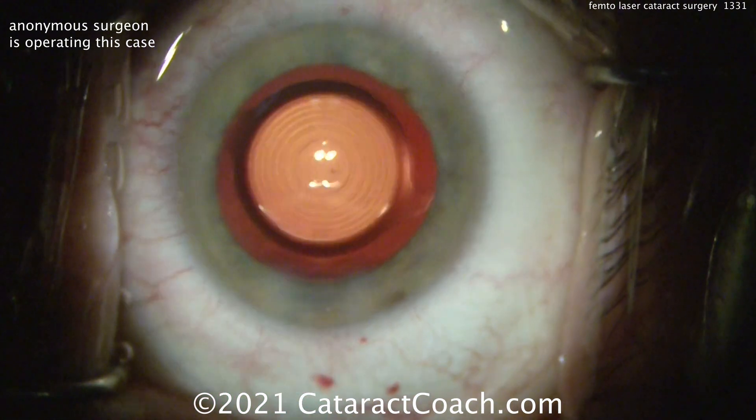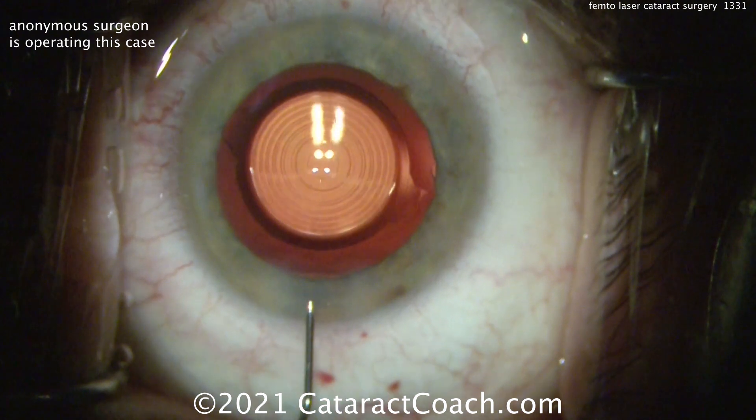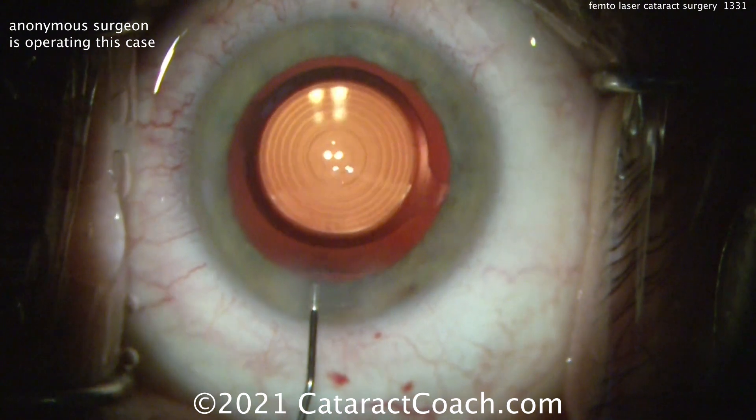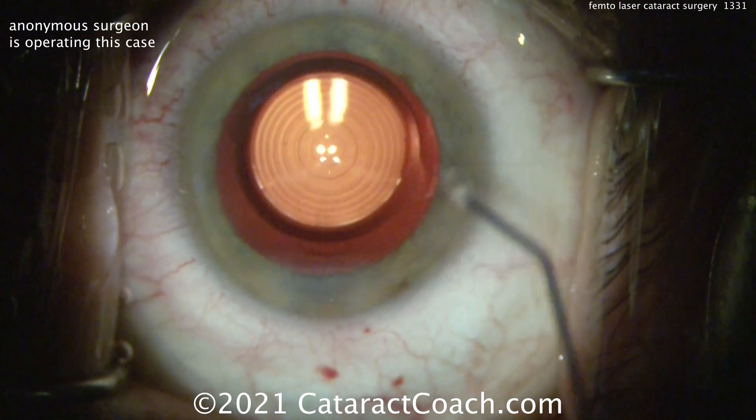So cleaning up pretty nicely. Looks like it's pretty well set — time to seal up the incisions, call it a day. So yes, if you have a femtosecond laser in your surgery center, definitely learn to use it. There are cases where you want a femtosecond laser.